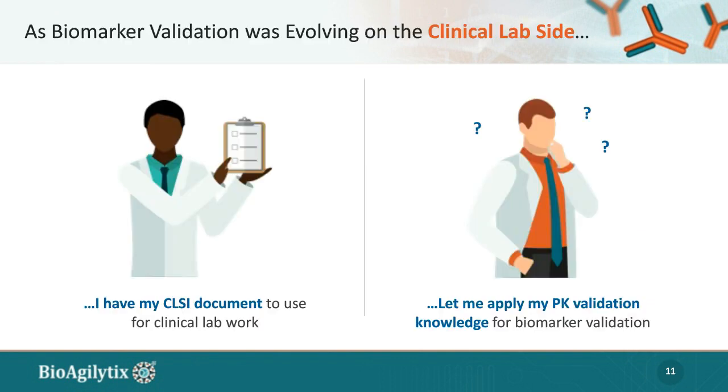Today, at least for the next several slides, I will be talking about the diagnostic world and the CLSI documents, the diagnostic world and the laboratories in the hospitals that measure your cholesterol and the general chemistry panel that they use. If you look at biomarker validation as it was evolving, the evolution started earlier on the clinical lab side. A lot of the clinical labs started coming up with the CLSI documents, which are very comprehensive and provide guidance on what to do and how to operate the clinical laboratories.